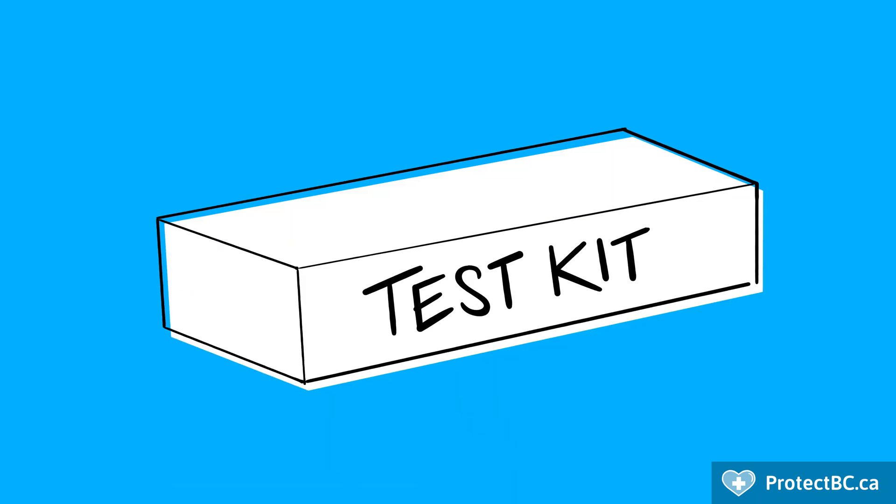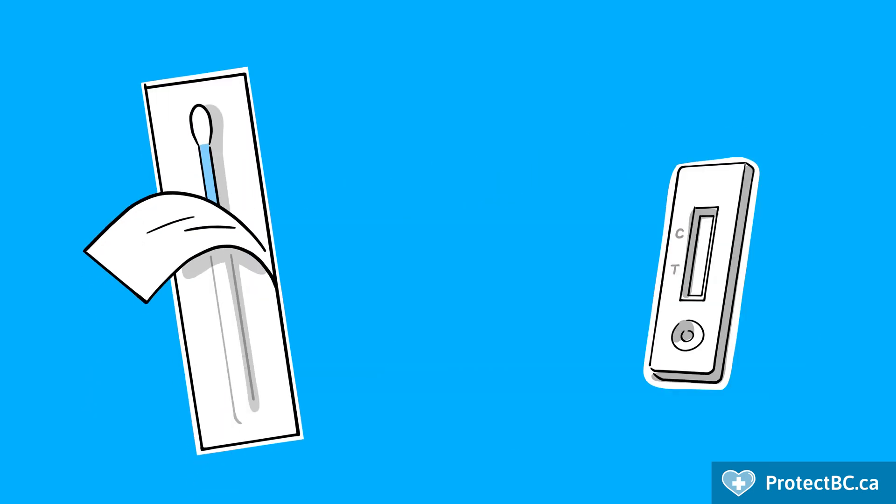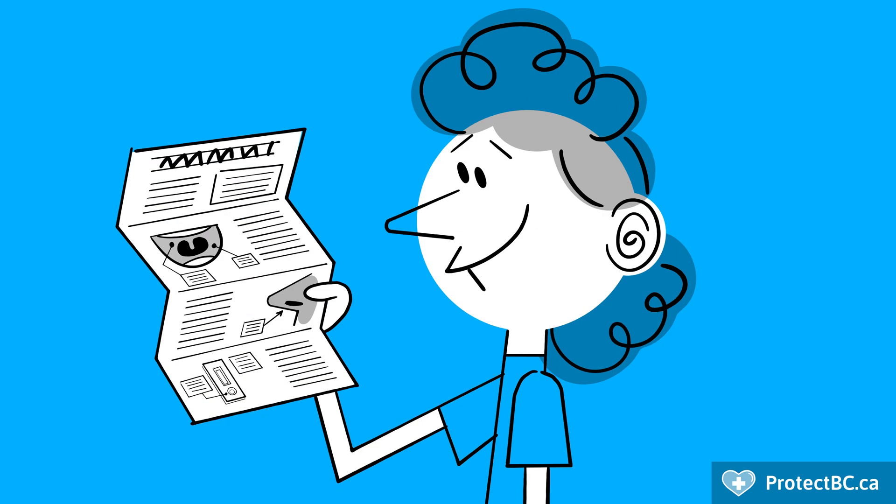While materials included in test kits may vary slightly depending on the manufacturer, all kits should include a swab, test device, extraction tube, buffer, and instructions.